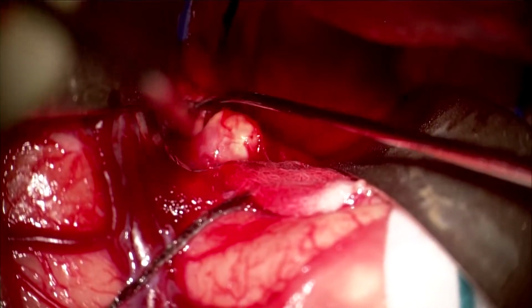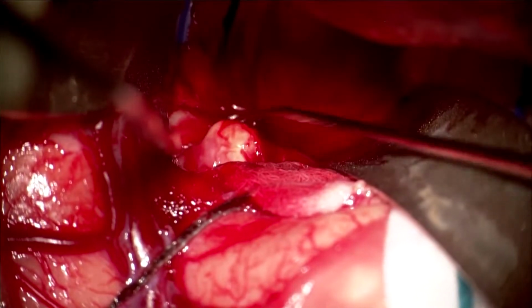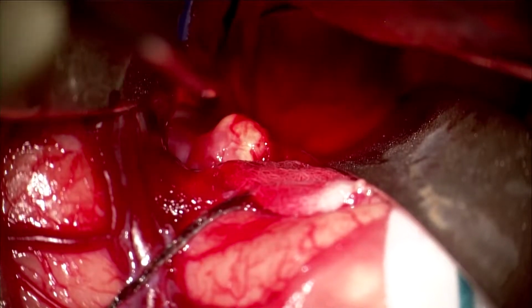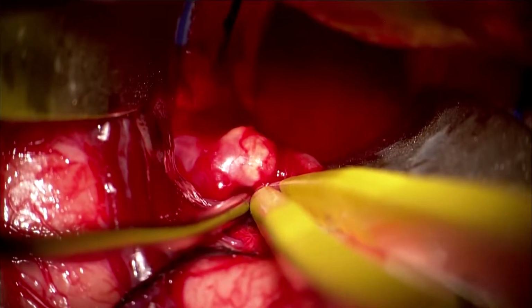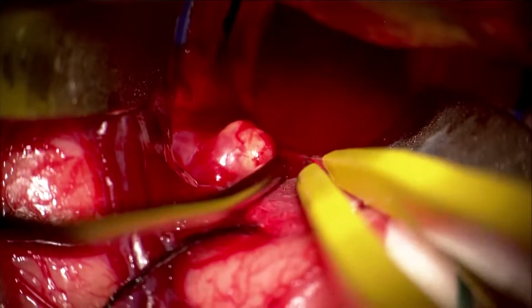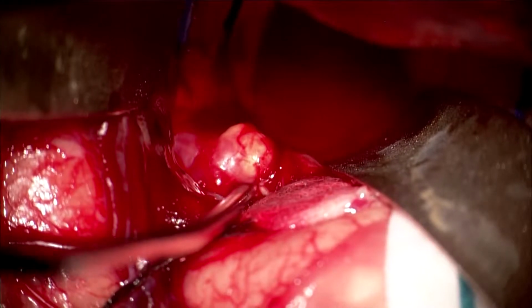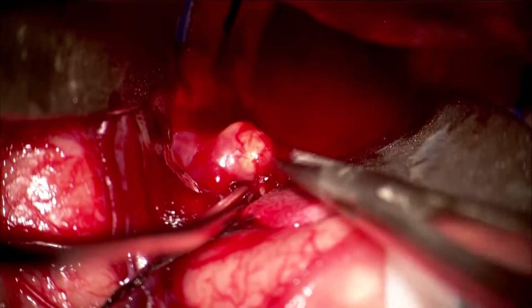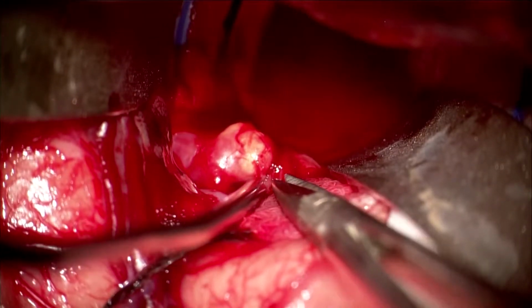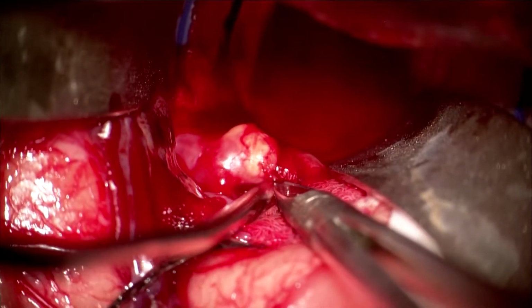The purpose for doing this is to make sure that you have complete visualization of all of the normal blood vessels coming to the aneurysm, but also bypassing the aneurysm and going to normal brain. If there are some adhesions that are significantly adherent to the aneurysm, cauterizing them, which was done there, and cutting them sometimes is safer than actually trying to dissect them off the dome of the aneurysm itself. As you can see here.